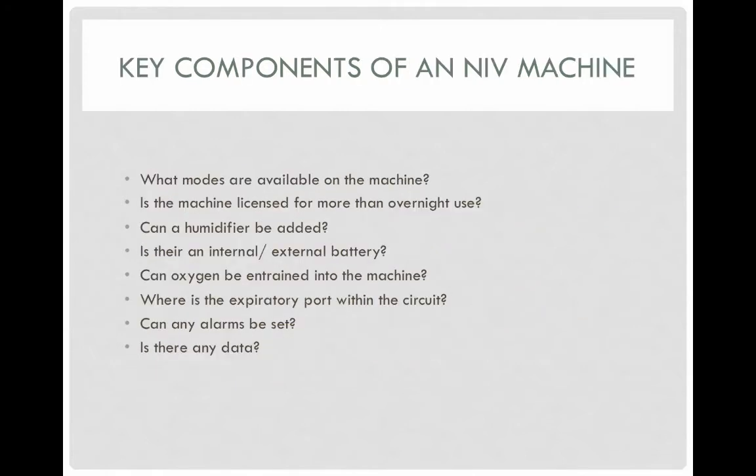Some of the questions that you want to know about looking at some of these different machines that we're going to be going through is you want to know what modes are available. What can be tricky about this is that some modes can have the same name but do different things, so each machine has their own definition of what that particular mode might actually do.